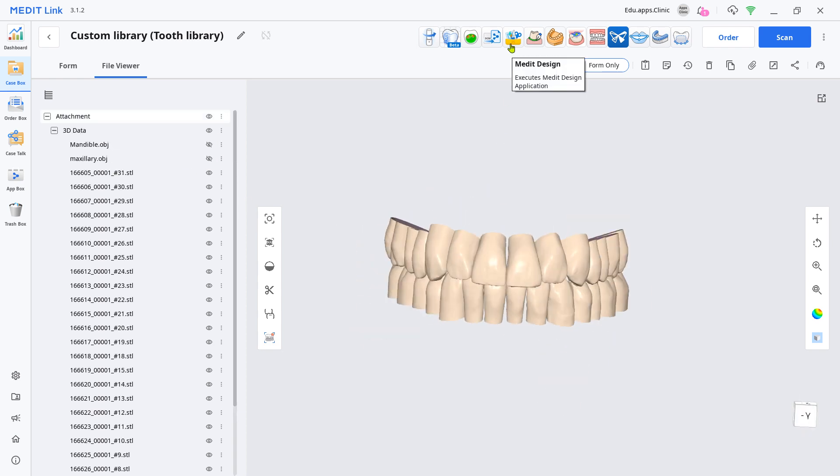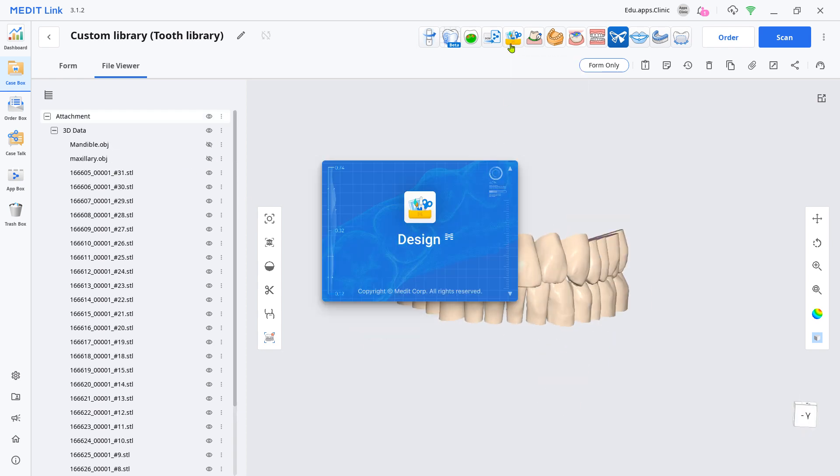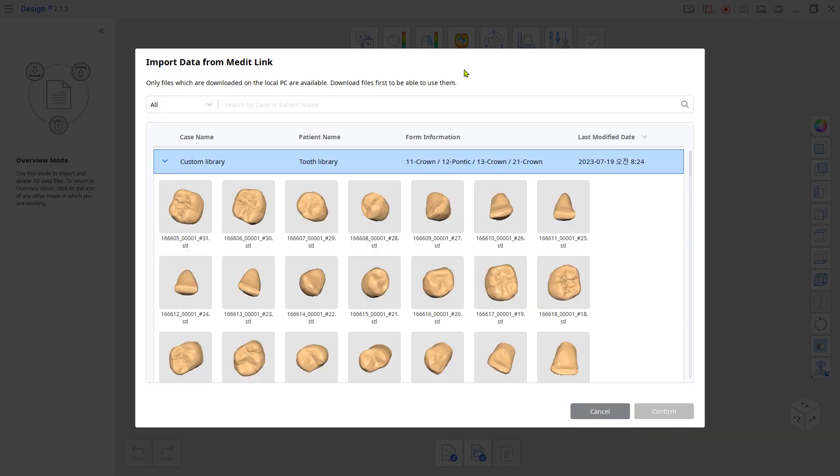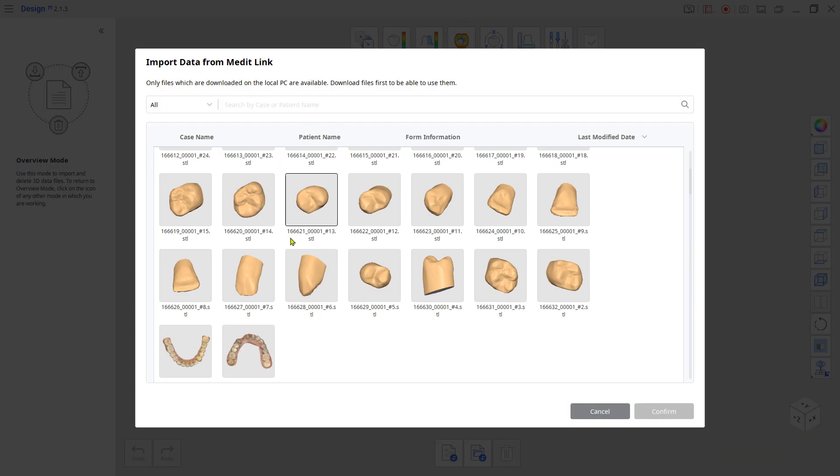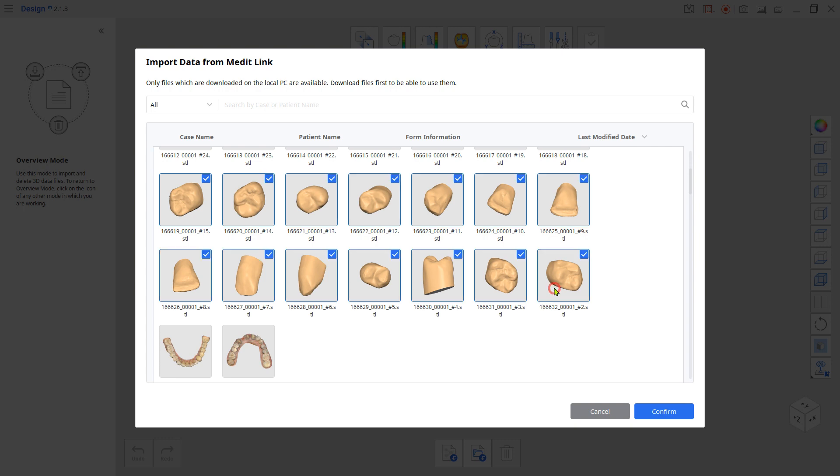Load the design app. To easily manage multiple teeth data at once, import the teeth arch by arch. Import only the maxilla teeth.